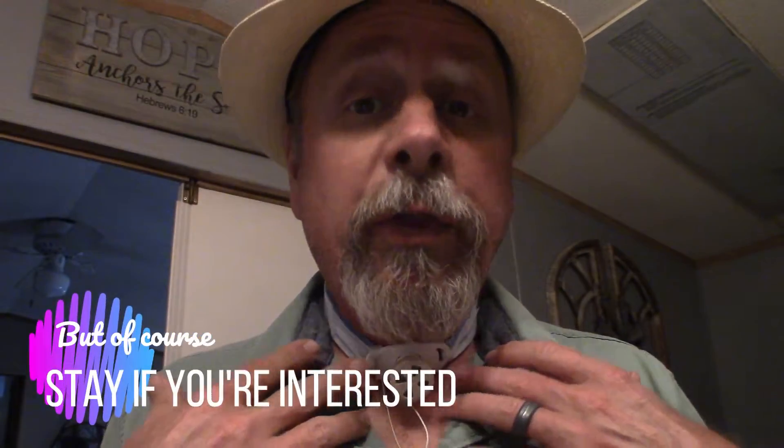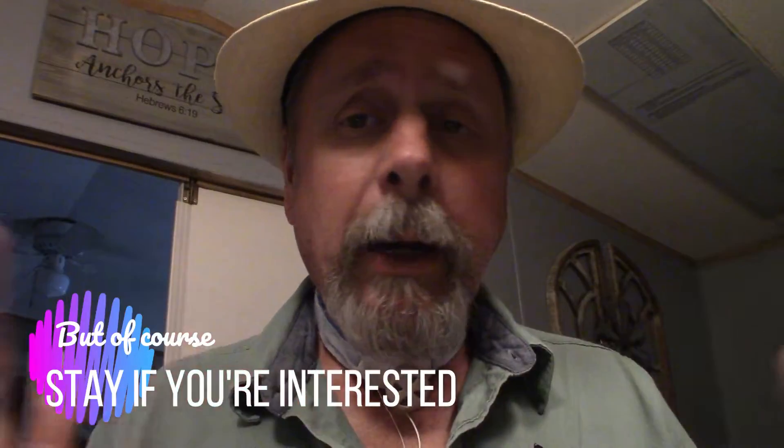So this video is not going to be for my typical urban outdoor audience. This is going to be for people interested in changing out the trach, and I'm going to go through it step by step and just show you how I do it.